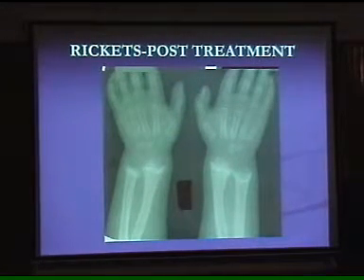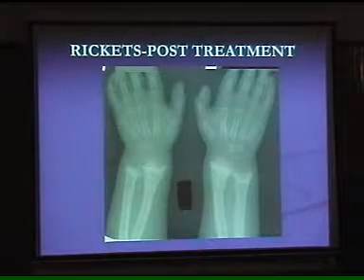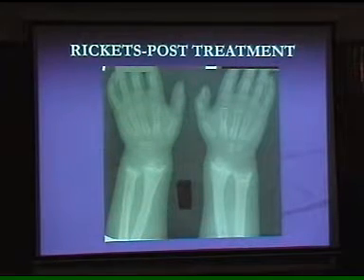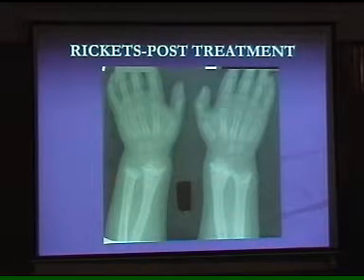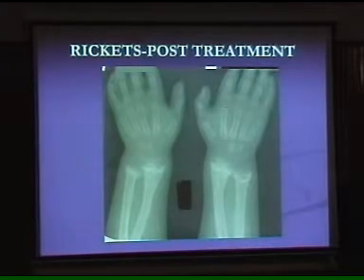That means if the patient has come to you for the first time and you do an X-ray like this, ask the patient whether she has taken any treatment, because if she has taken some haphazard treatment, because of the deposition of calcium back over the area, you will find these vertical and horizontal dense lines at right angles. Dense lines mean that in some way the patient has taken some treatment, which may not be complete, because of economics, because of a change of doctor, because of any reason, or because of negligence, she discontinued treatment. But if you find these dense lines, that means the patient is a known case of rickets, and she has been given treatment for the child but not the complete treatment.